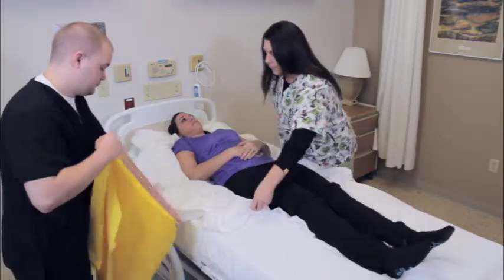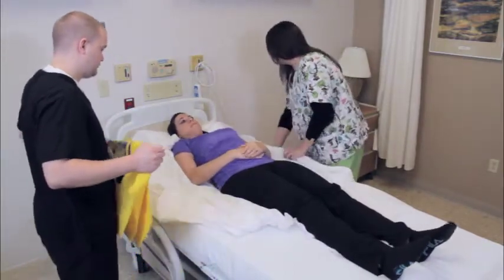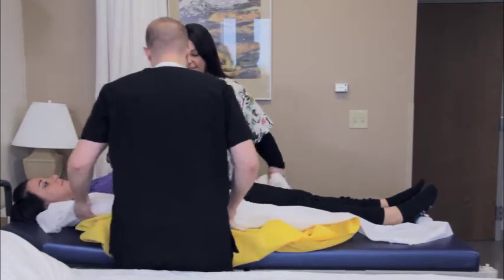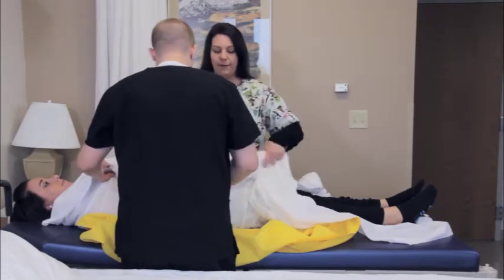Remember that the force required to reposition a patient using Slip is very small. Do not pull hard and do not lift. Simply pull the draw sheet in the desired direction.